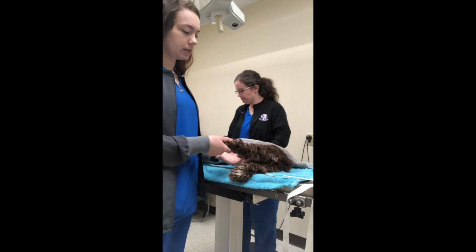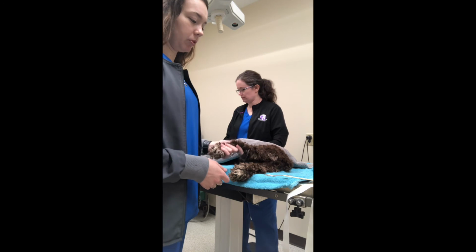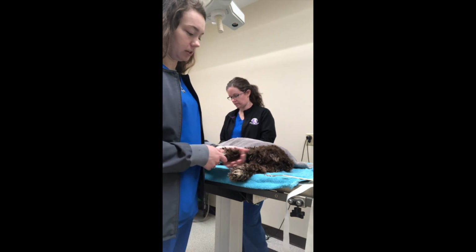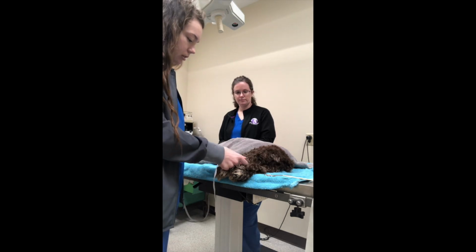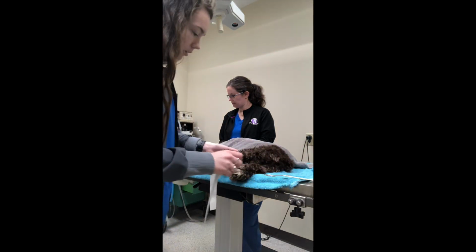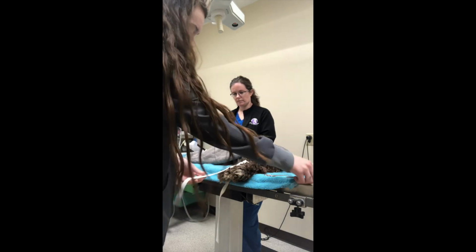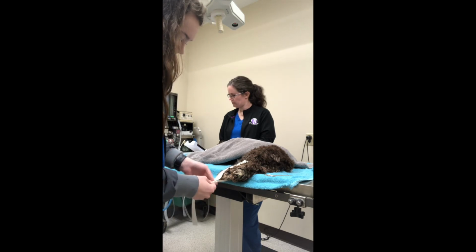I'm going to place a modified Robert Jones bandage and a splint as well. The modified Robert Jones bandage is used for compression after surgery, and then the splint is going to be used for distal limb fractures. So I'm going to start by placing my stirrups on the distal third of the leg. And I'm going to use this tongue depressor to attach to each piece of this white tape.